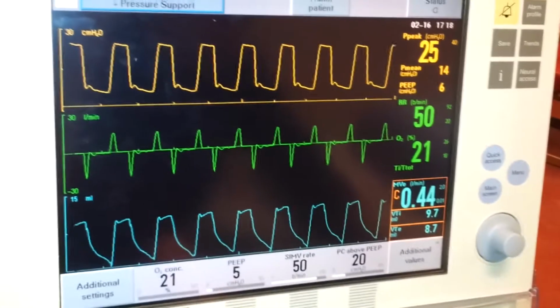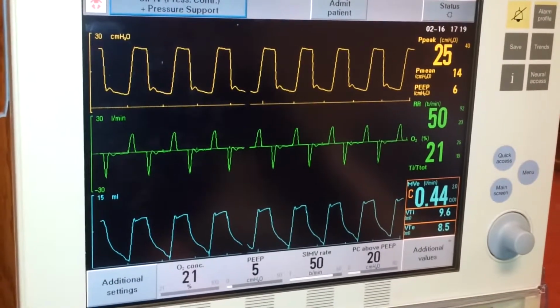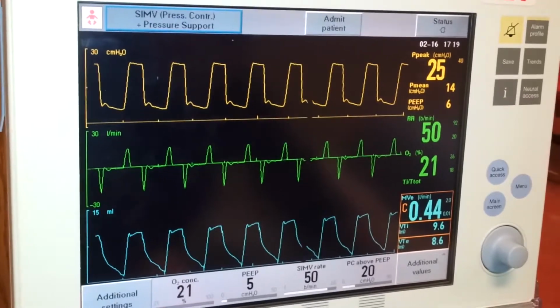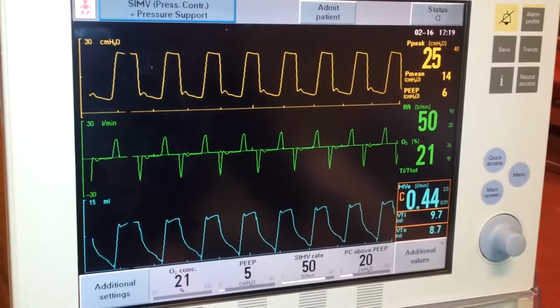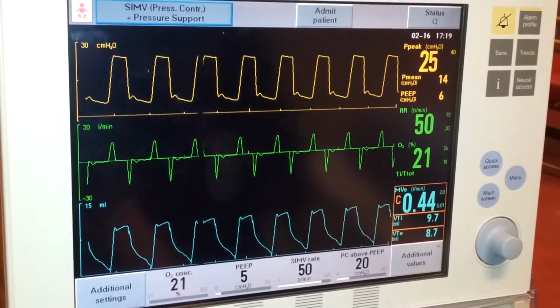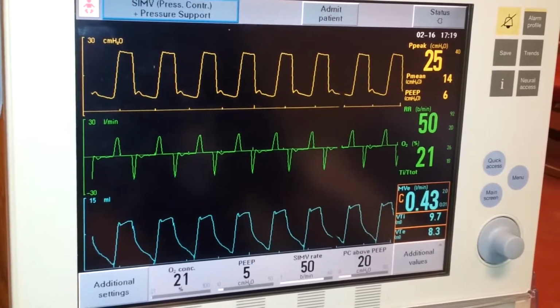So, in the case of low birth weight infants, you would turn tubing compensation off to increase the tidal volume being read and to avoid unnecessary alarms. So the second step of the CBO is initial ventilator settings and alarms.